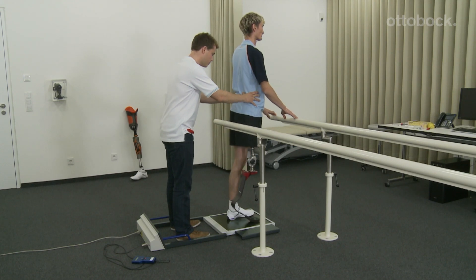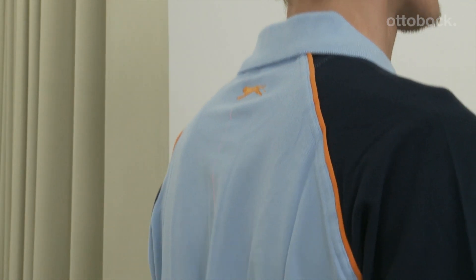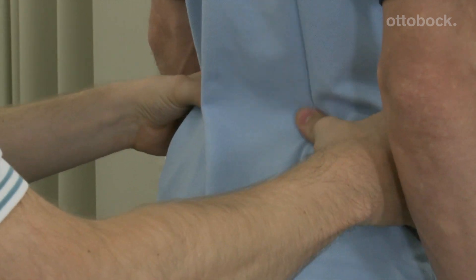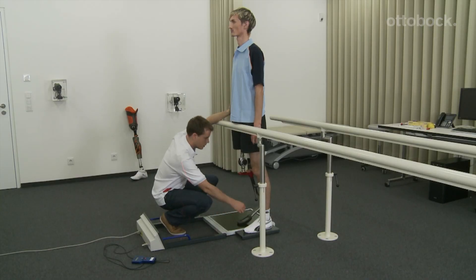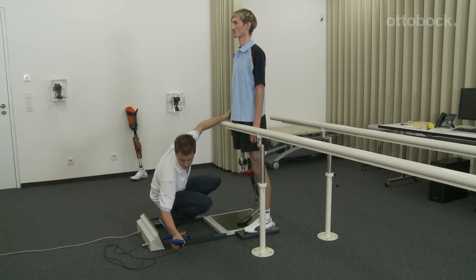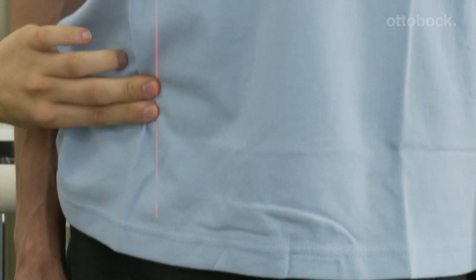The exact physiological prosthesis length can be determined with the laser posture device. The user now stands with both legs on the device. If the prosthesis length is correct, the load line of the laser is projected onto the spine. The user then changes position and stands with only the prosthesis side on the force sensing platform. The prosthesis should be loaded with 35 to 45 percent of the body weight. The laser line must run through the middle of the foot, the knee joint, and the anterior superior iliac spine.